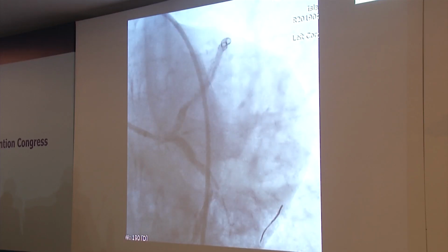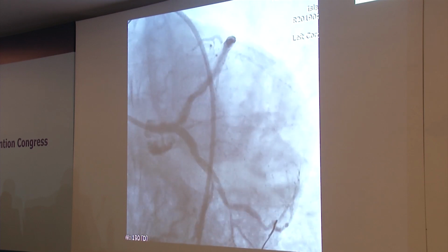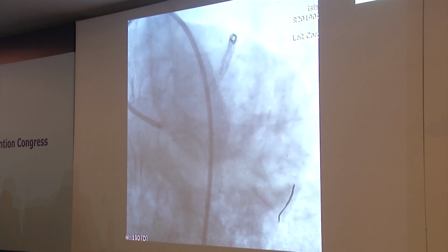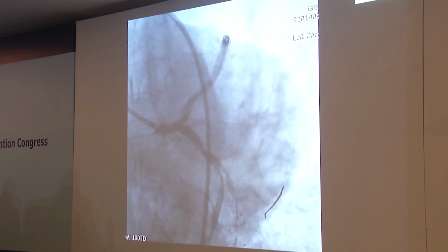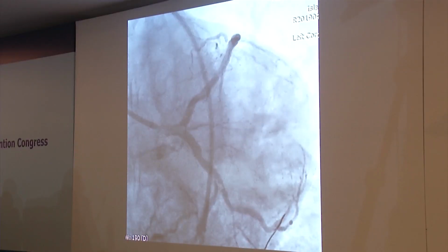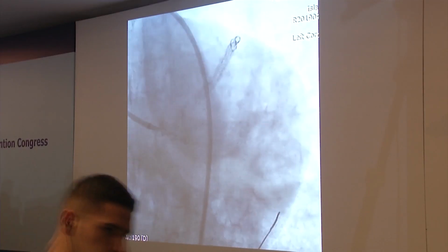Anatomically it's a problem. You're absolutely right. Just looking at this, the law of bifurcation is left main equals 0.67 times LAD plus circ. So here you have a smaller left main than either. So even without imaging, you know that you're starting with pathology in the left main. You're right. That's why he has left main disease from the beginning, and that's why we discussed surgery with him again and again. My colleagues in the past discussed surgery with him because of this left main disease. How about the LAD ostium after you did the left main to circ stent? I think it's not healthy. It looks like a pressure lesion or haziness.